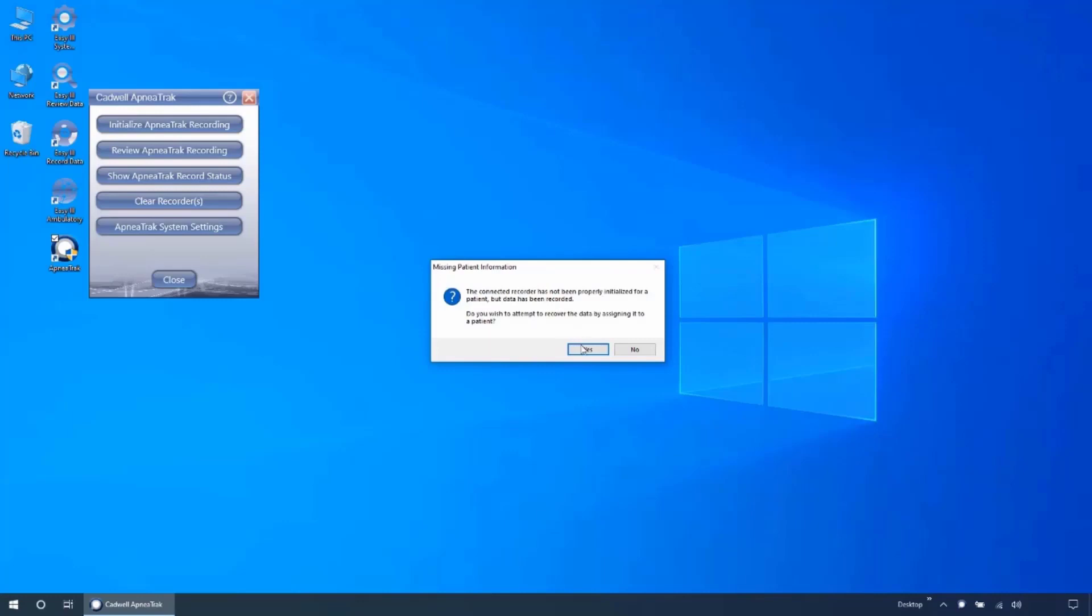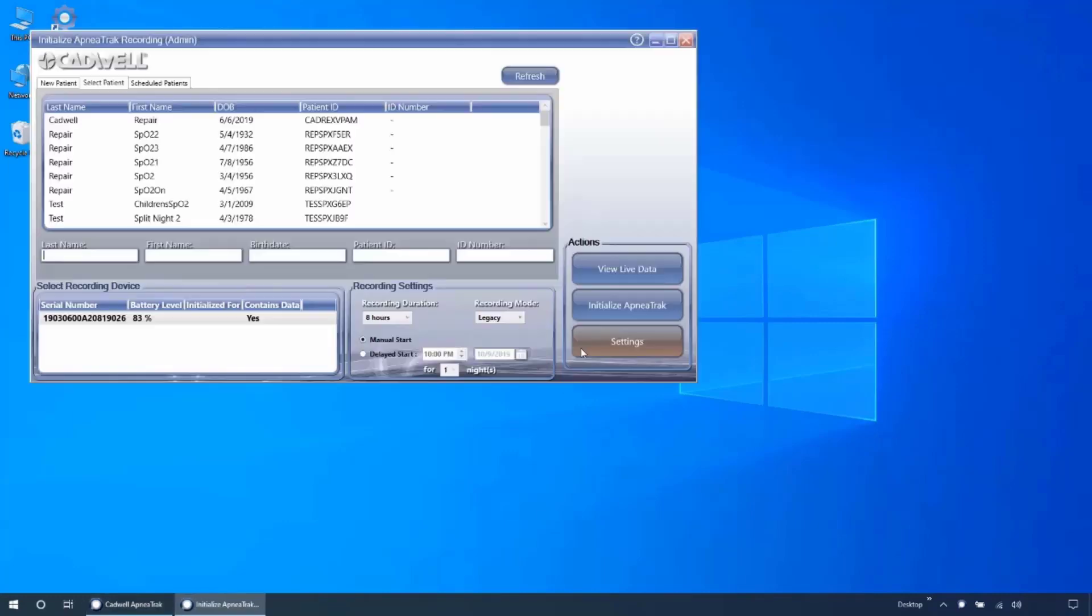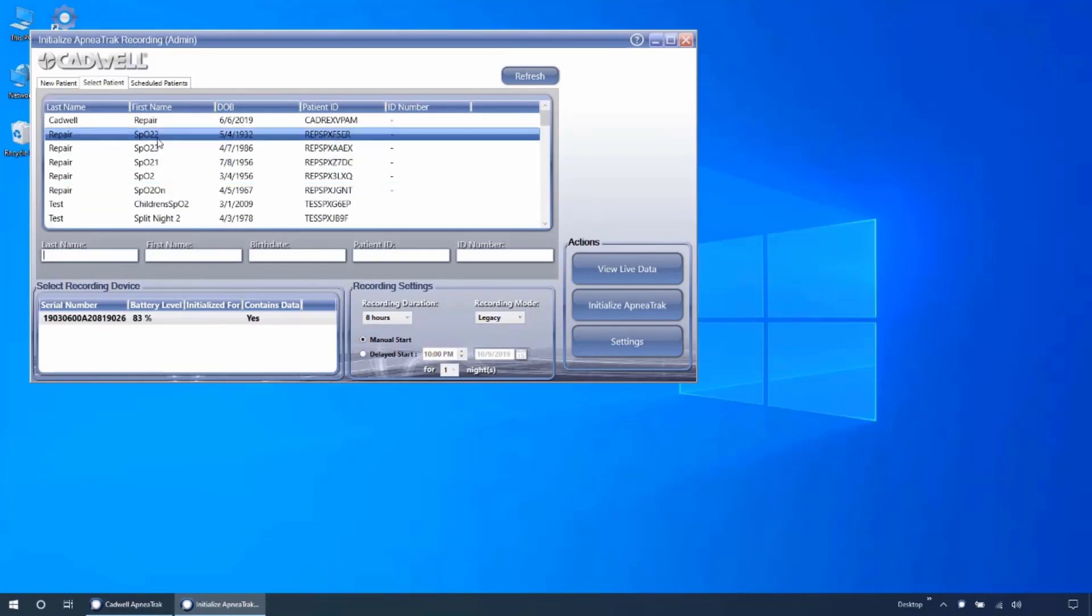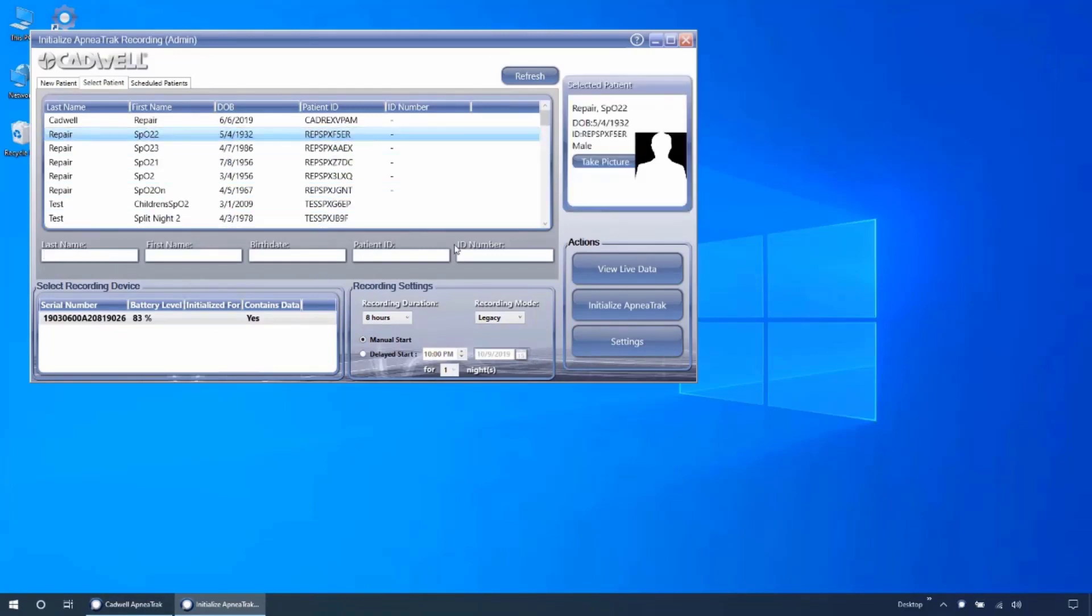Clicking yes will take you to the initialized ApneaTrak dashboard where you will enter the patient information and click initialize ApneaTrak.